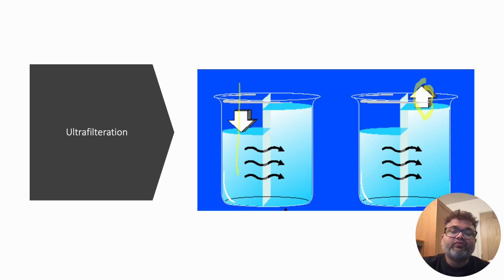So there will be flow of fluid from one chamber to another because of pressure, either positive or negative. Then it is called ultrafiltration, and this mechanism is mainly used for removal of fluid, and most machines use it with dialysis and even with hemofiltration, which we'll discuss later.